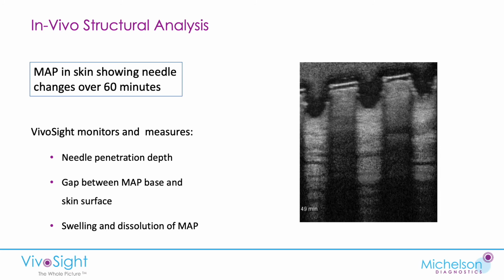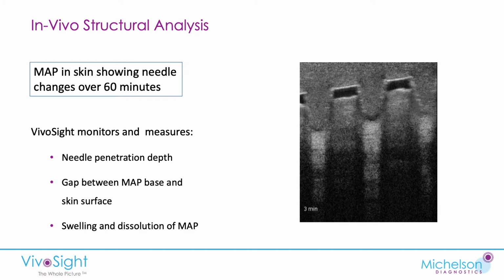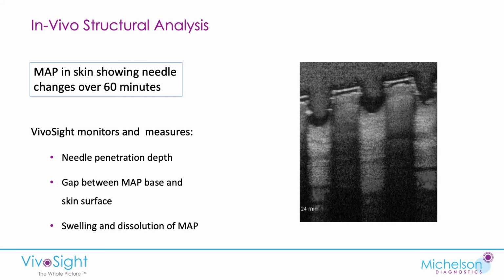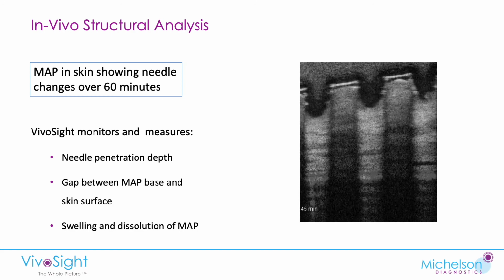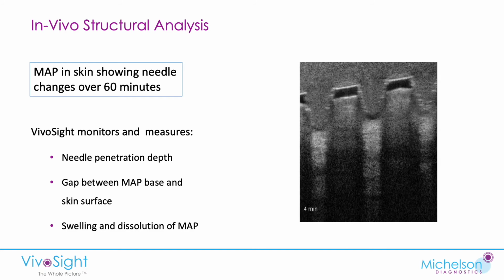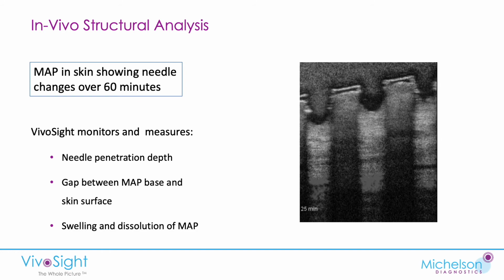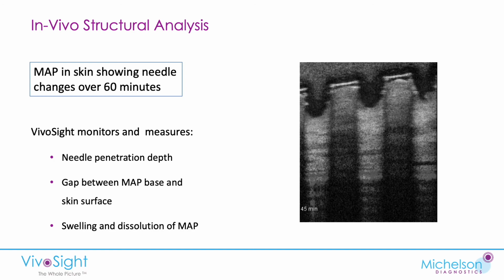And you can see that the microneedles have turned to, let me just run that again. In it, you can just see the sharp microneedles starting to dissolve and turn into a black color as they hydrate. You can also see the air gap shrinking. I'll run that one more time. Immediately post-insertion, we have a large air gap. We have pointed needles, and here they are steadily dissolving and swelling.